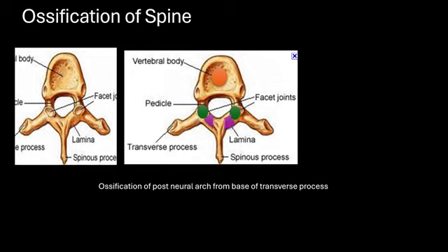This is important since the hallmark of spina bifida is the defect or absence of posterior neural arch ossification. The ideal way to confirm spinal normality is to demonstrate continuous intact posterior ossification at all spinal levels during the ultrasound examination.